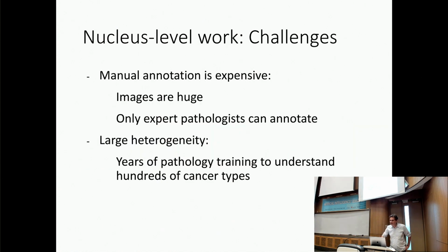So what if we can actually count nuclei, classify nuclei? Okay, we can now talk about segmentation and so on. Again, there are millions and billions of nuclei in those images. And they're really different. They look different for each different tissue, and you need pathologists to annotate them.